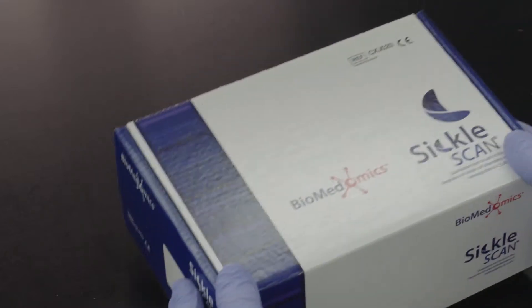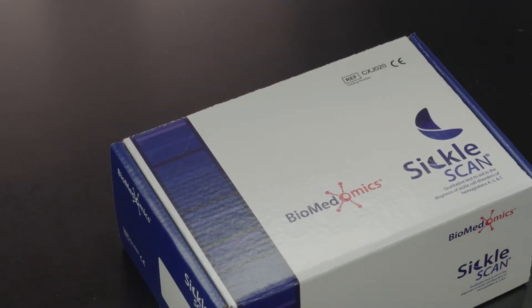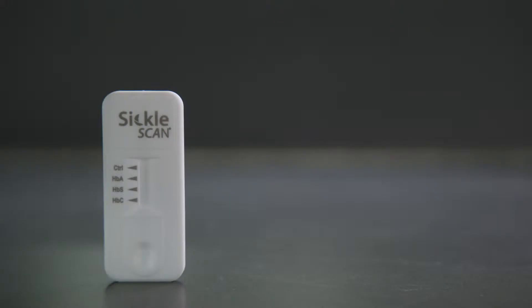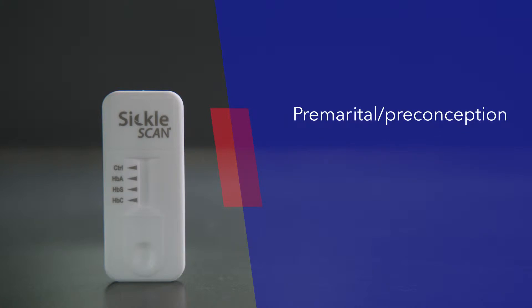Now, SickleScan provides quick and accurate results in the detection of hemoglobin A and mutated hemoglobins S and C, all in one easy-to-use field test. This test allows the user to distinguish between normal, carrier, and diseased patients—all vital information when making treatment and lifestyle decisions to manage the disease.